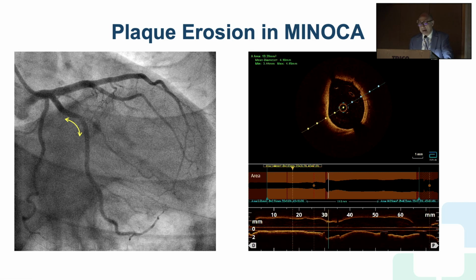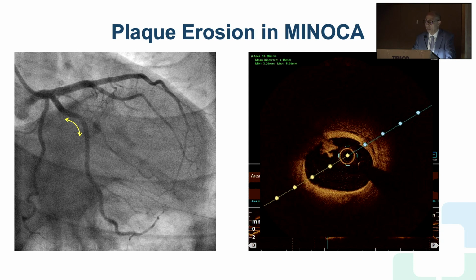And as we pull back across that branch, we could see there's a little bit of thrombus there, and I'll show you. This is the still frame. So an intraluminal thrombus, we can see through it a little bit. It's causing a little bit of shadowing, but it's not completely red, more white than red, although maybe there is some shadowing. And there is some haziness in the surface underneath, but it doesn't look like a complete break.